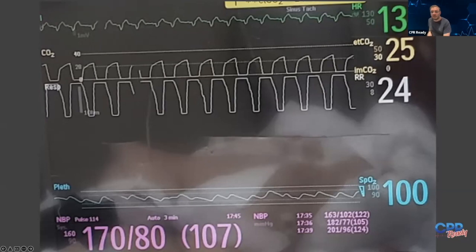So this is a patient that's telling you they're having trouble breathing. I can't breathe. I can't breathe. And you're looking at their O2 sat. It's 100%. And maybe you haven't said this before, but I've heard it said in the field at least, oh, you're fine. Your oxygen's 100%. There's nothing wrong. You're getting plenty of oxygen, as if it's all in the patient's head, right?